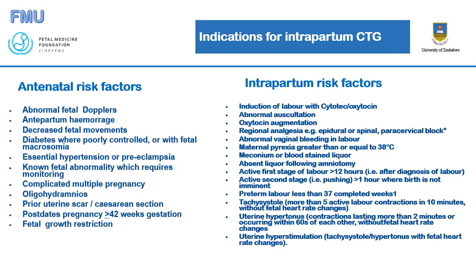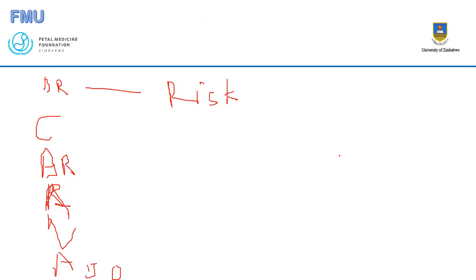Not every woman needs a CTG. Some women can still be monitored intermittently the way we have been doing, but that way has to be improved to align with the recommended way. But those are the risks.